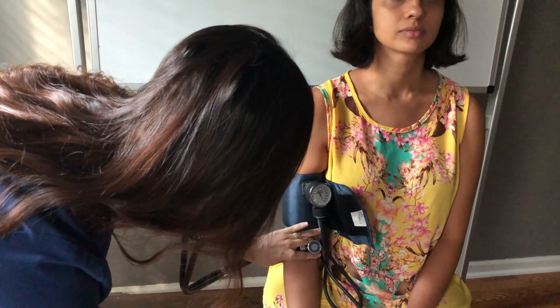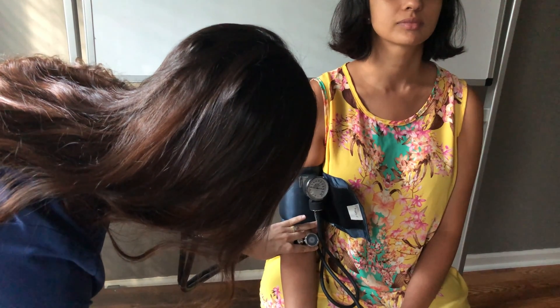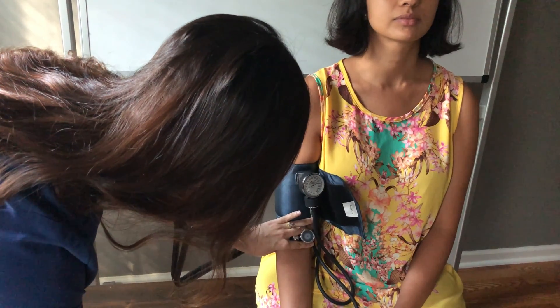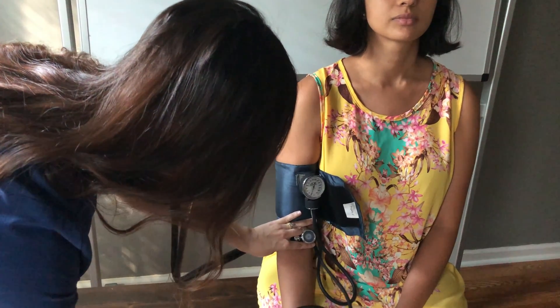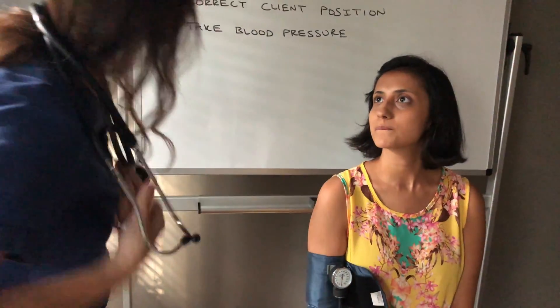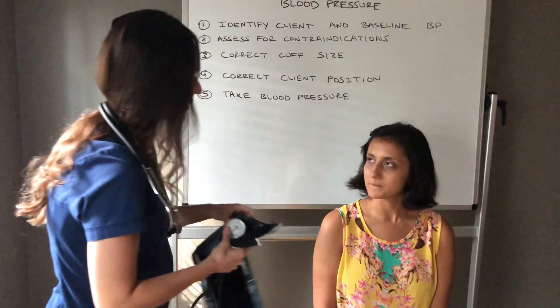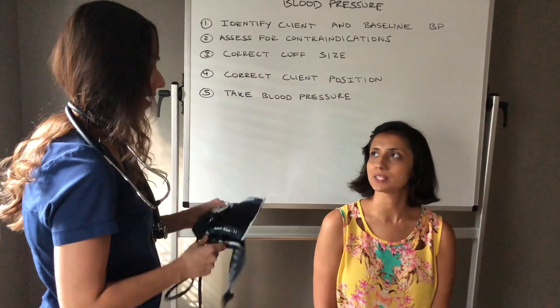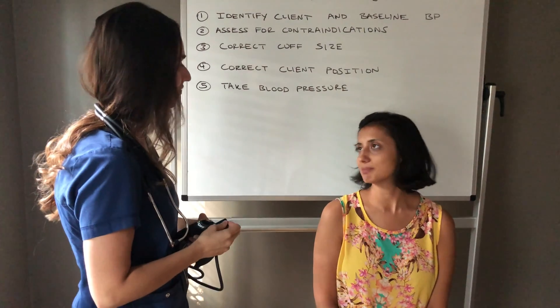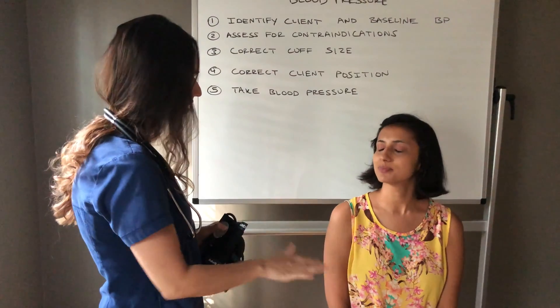We inflate to 160 for Ms. Rago and slowly deflate. Ms. Rago, your blood pressure is actually slightly lower than normal. Your blood pressure right now is running 110 over 72. Is that okay for you? Yes. Is there anything else I can do for you? Here's your call button — anything you need, please call out immediately.